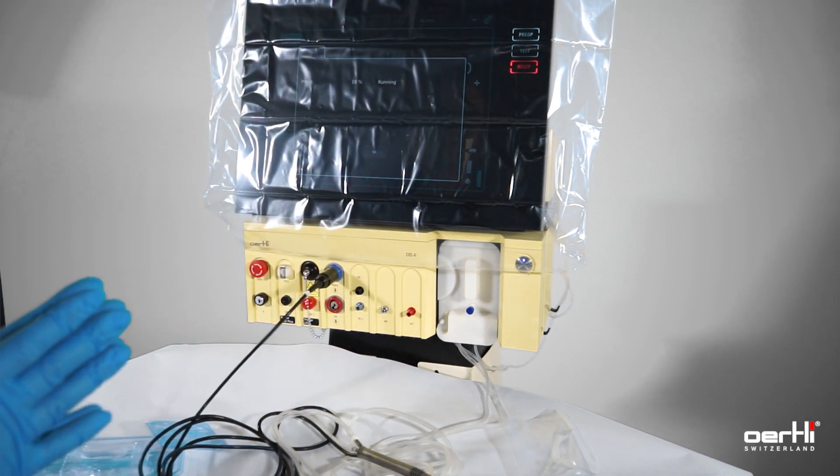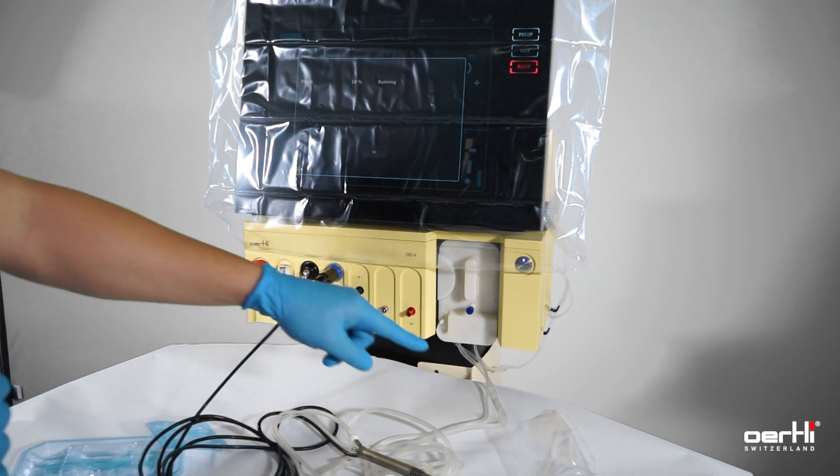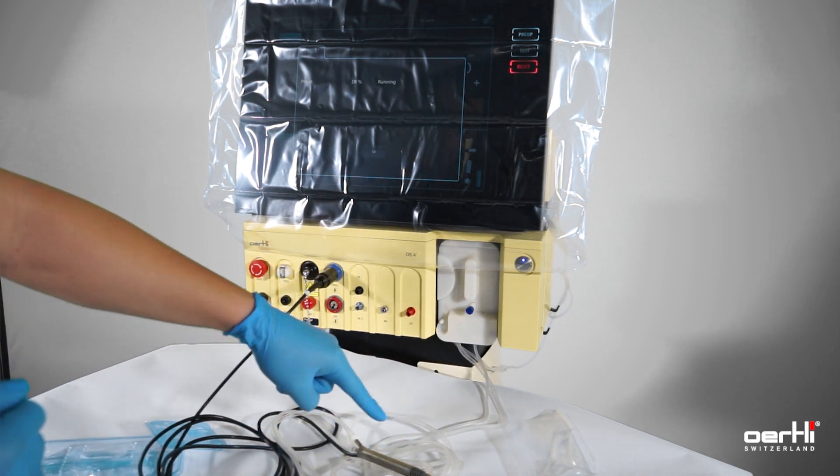It may take approximately 60 seconds. As you can see, the BSS is now filling the tubing.